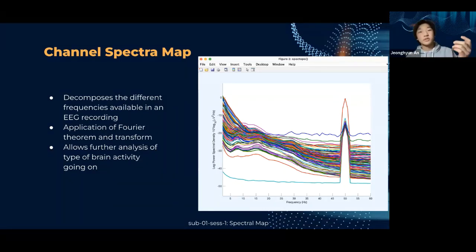Now, for instance, we're going to have signals that are 20 hertz, 15 hertz, 8 hertz, and maybe a 50 hertz signal from the electrical line noise. Instead of having 4 of these sinusoid waves separately, we're going to have all of them added together. And it's going to be hard to tell them apart visually by the human eye.